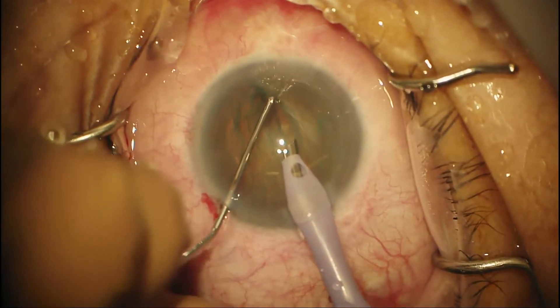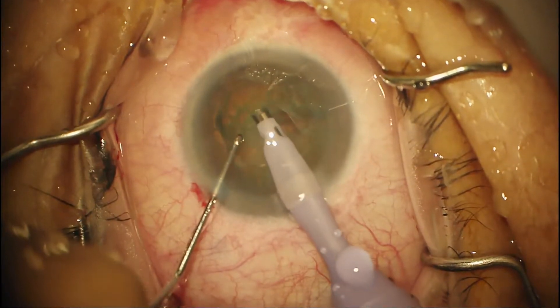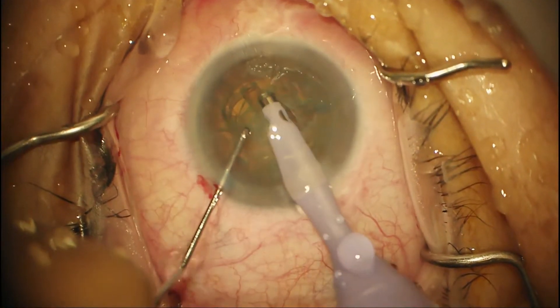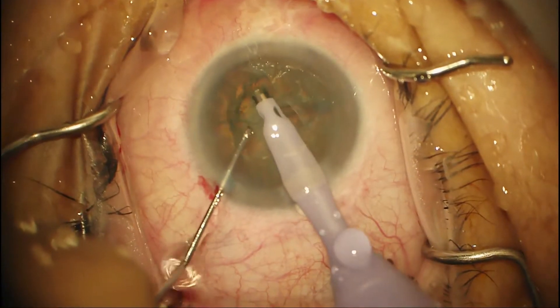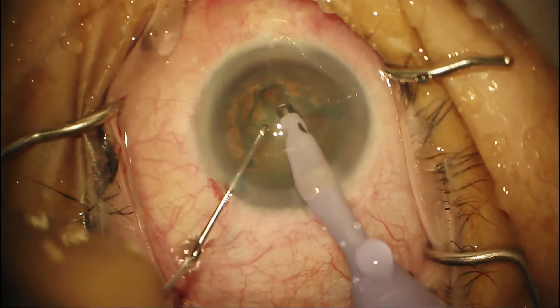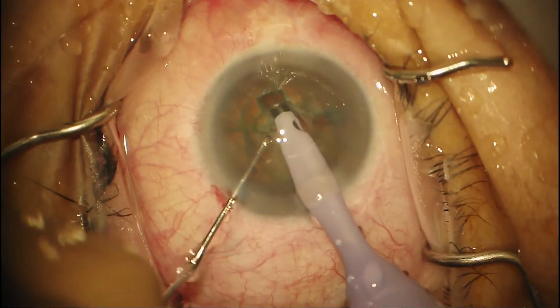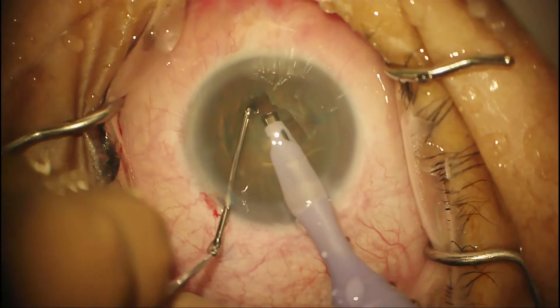Using the second instrument — like pushing on a door — we rotate. The more peripherally you push, the less pressure you have to use, just like pushing a door is easier the farther away from the hinge you are. Now we're making another groove. The depth is easy now because we know the full thickness — you want to go about 80% and then crack.